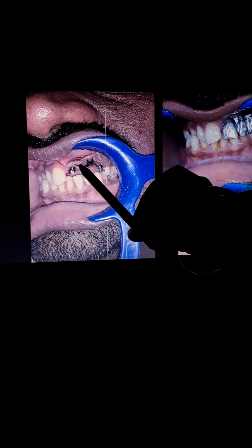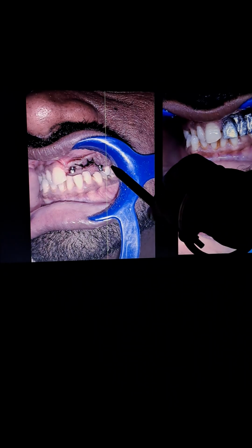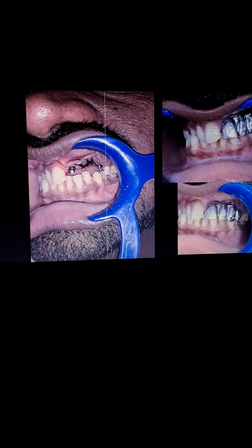The first implant was a midline implant engaging into the anterior nasal spine area, placed right in front of the nasopalatine foramen. The second implant was in the first premolar area. Upon extraction of the aberrantly placed central incisor, I gave sutures, and simple alginate impressions were made, and the technician was asked to do the metal trial.